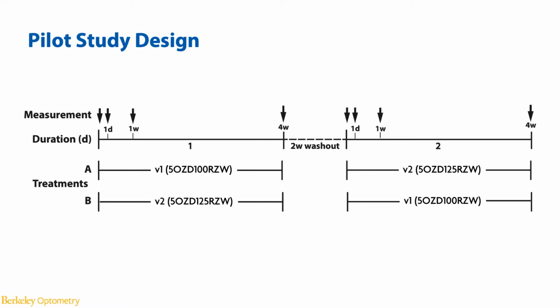So for this pilot study, we have recruited 6 eyes from 3 subjects, and this is a self-controlled crossover design, which I will explain in a little bit why the importance of having this design. Essentially, each subject will be wearing 2 different designs at the same time. This allows a concurrent interocular comparison between the 2 designs. And we fit them and see them back at 1 day, 1 week, and 4 weeks.